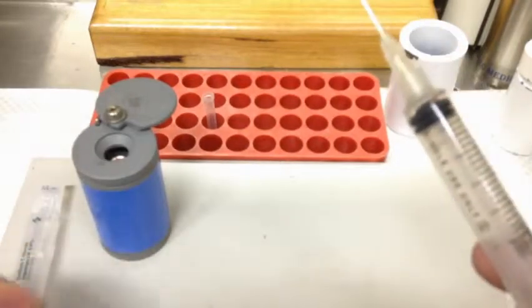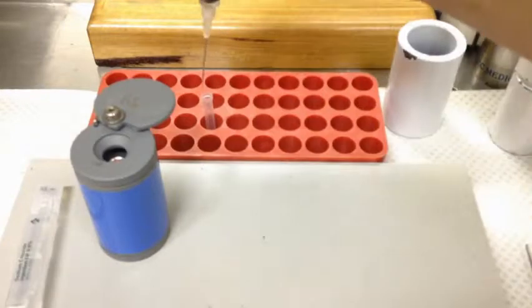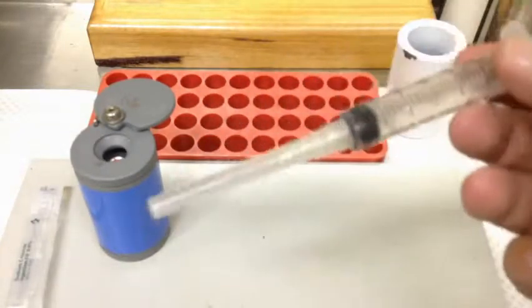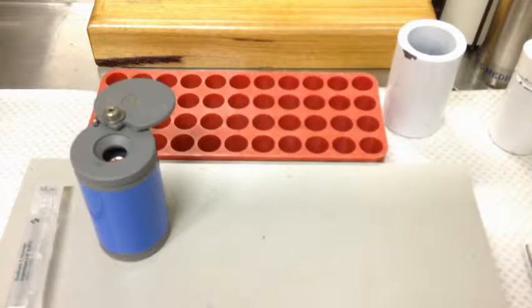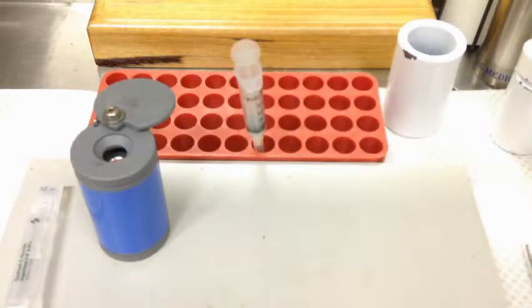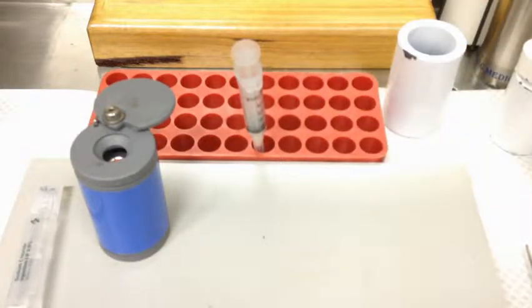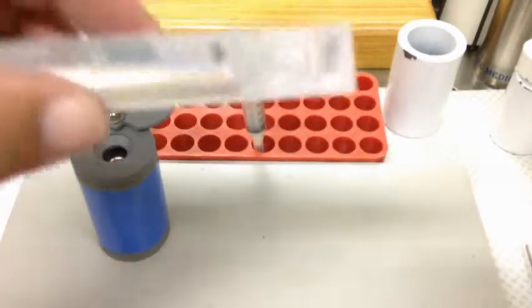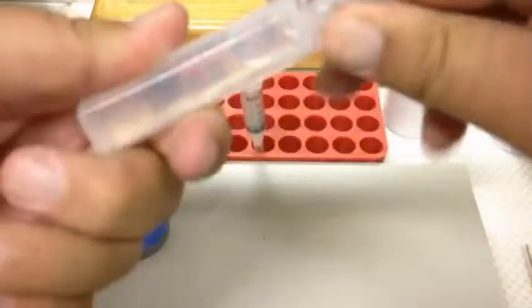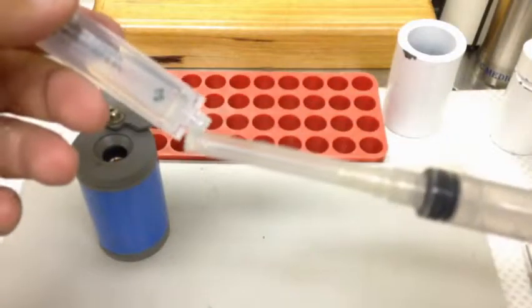Pop your eluate back down, tuck it into the side, recap, and then that goes to the dose calibrator. Pop it in the dose calibrator — our calculations were perfect, as you would expect, so we know we've got our activity. You're not going to leave that lying around because it is radioactive, so we want to do this relatively fast. The next part is to dilute it, so we're going to get our saline.